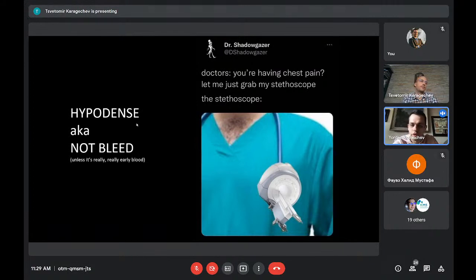I'll show you some tools that I use every day because we see probably 100 brain CTs every week, and still I open a textbook, an article every day to check something. So don't think that you have to know everything. Just try to understand the underlying connection.